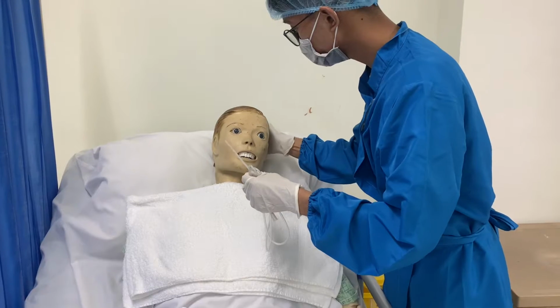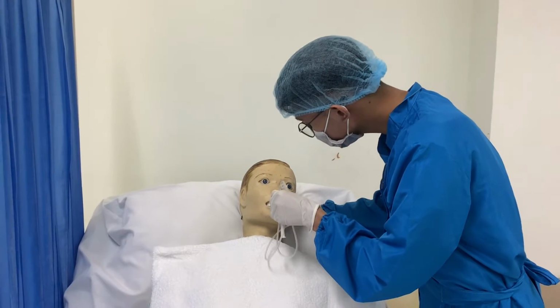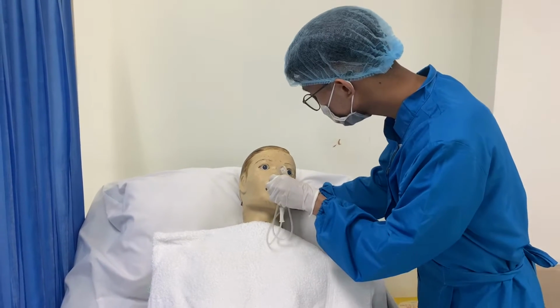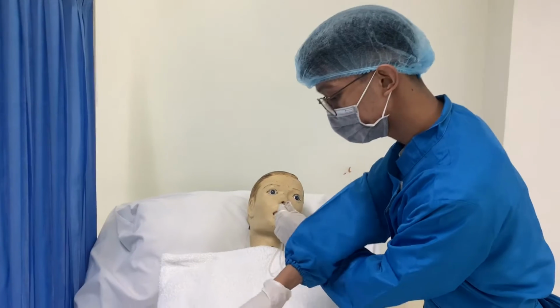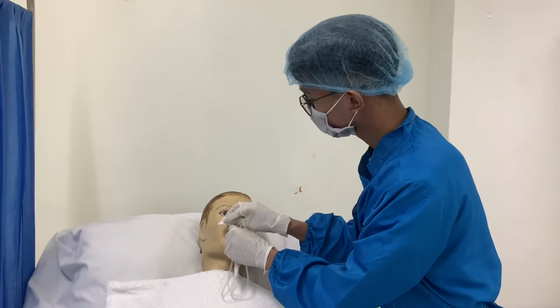After selecting the appropriate nostril, ask the patient to slightly flex the head back against the pillow. Gently insert the tube into the nostril while directing the tube upward and backward along the floor of the nose. The patient may gag when the tube reaches the pharynx. Provide tissue for tearing or watering of eyes. Offer comfort and reassurance to the patient.